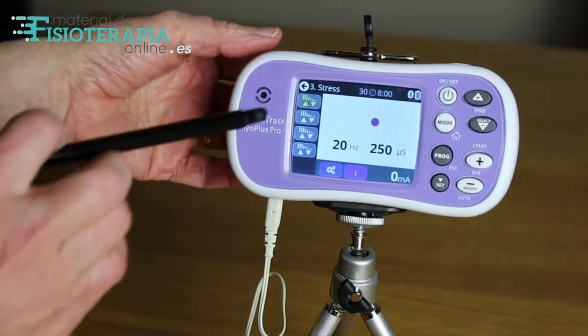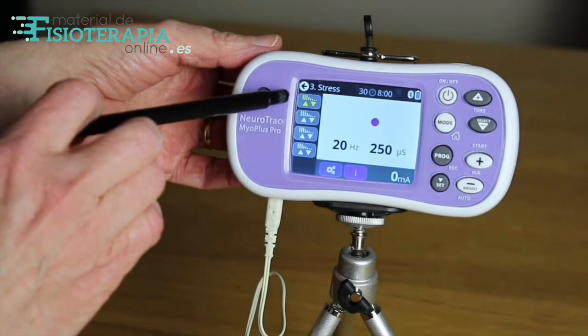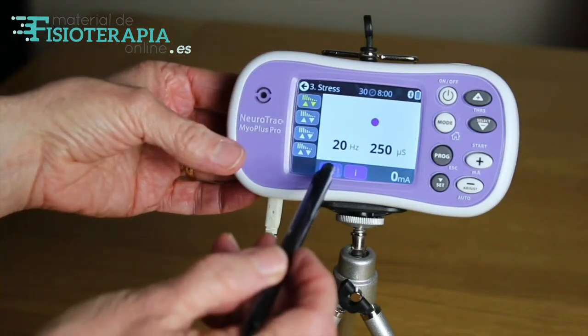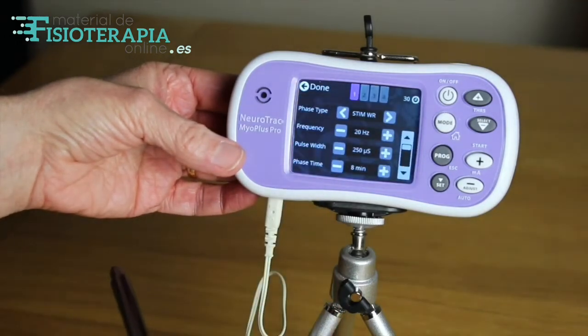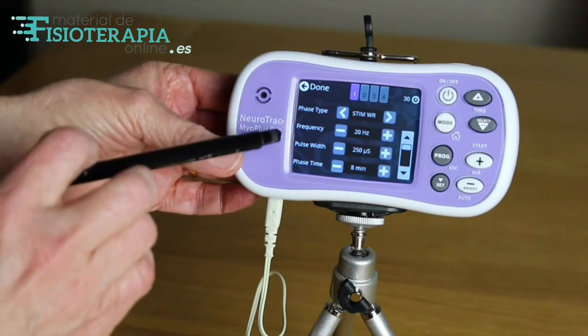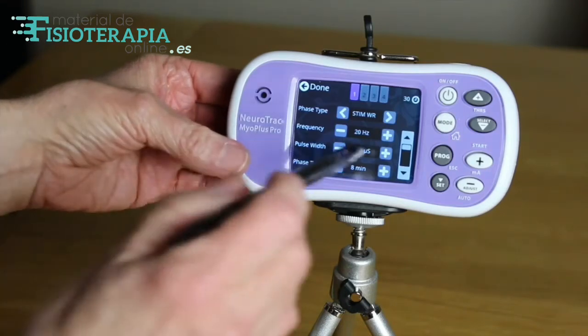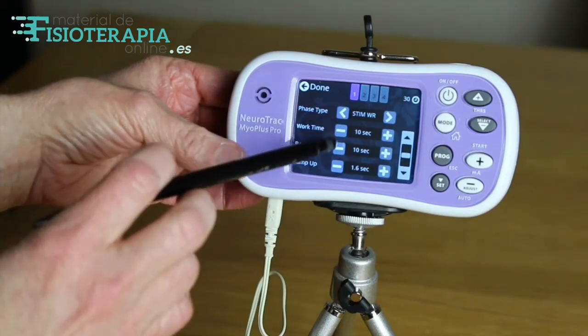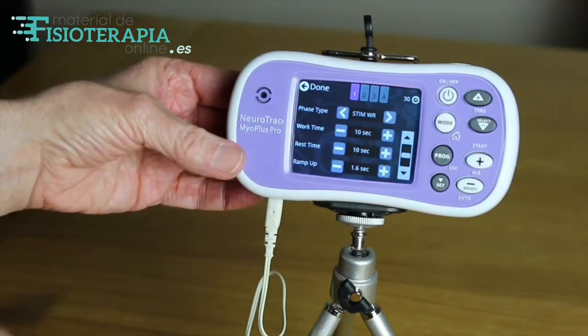The first phase is highlighted in yellow. You can view the specific details of each phase by pressing the icon at the bottom of the screen. Here we have access to information such as the frequency, pulse width, total phase time, and that the muscle will receive stimulation for 10 seconds and then rest for 10 seconds.